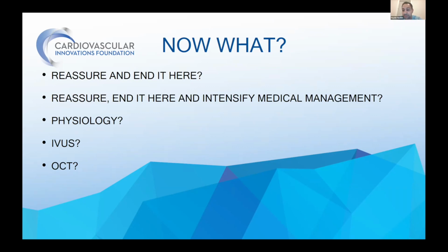First of all, let me remind everyone, we're doing a webinar on intracoronary imaging. So by definition, the last two options are going to be correct. But apart from that, I guess the question here is more about the patient having rest symptoms, like rest pain. And he does have this intermediate lesion that looked kind of vulnerable on CT with a soft component. So in my mind, OCT is probably the better way to go, because you can look for areas of vulnerability. Is there any thrombus, any rupture, anything that might make us more likely to treat this patient? And if the patient was completely stable, we can do physiology as well. But here, in my mind at least, we're looking more for a cause of the patient's rest symptoms.